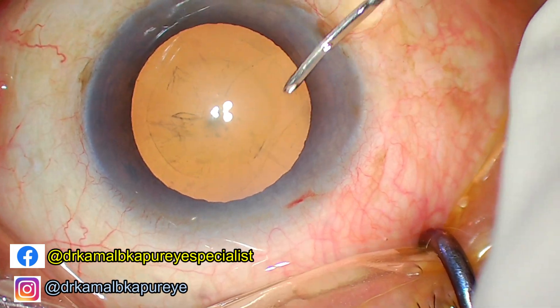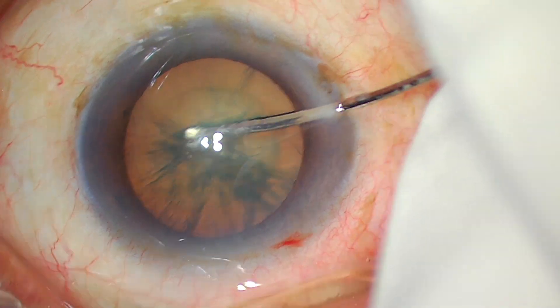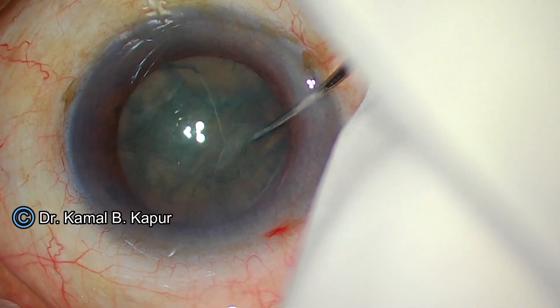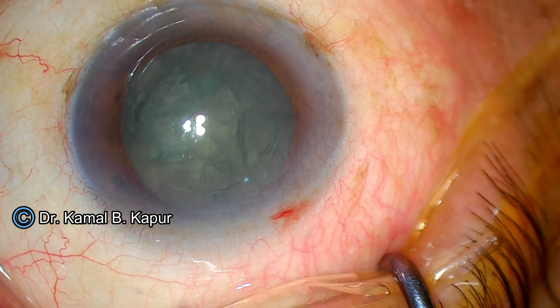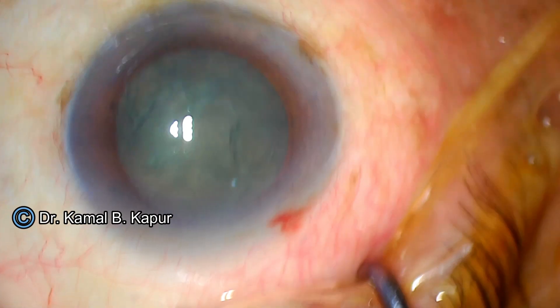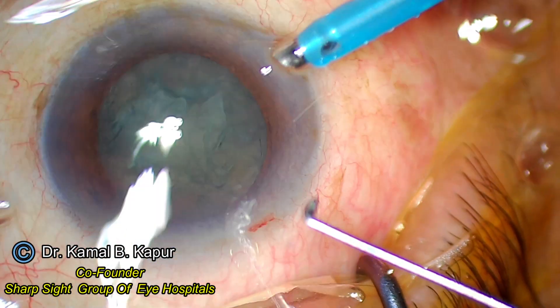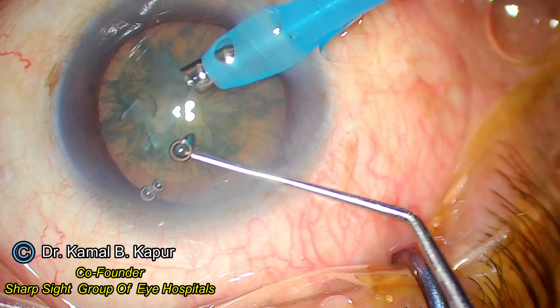We proceed and perform a cortical cleaving hydrodissection. You can see it is a very soft cataract with mere fluffing of the cortex. Doing a peripheral chop in a soft cataract can be tricky, but we may be able to evaluate once we remove the floating cortex in front of the nuclear roof. For a peripheral chop it is always a good idea to have slightly more exposure compared to a vertical chop.